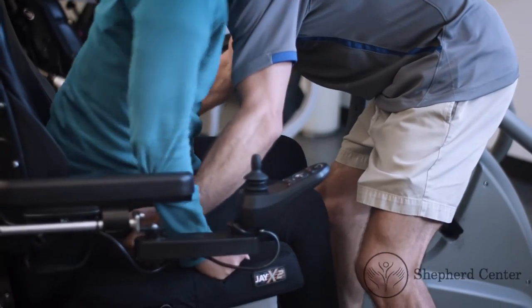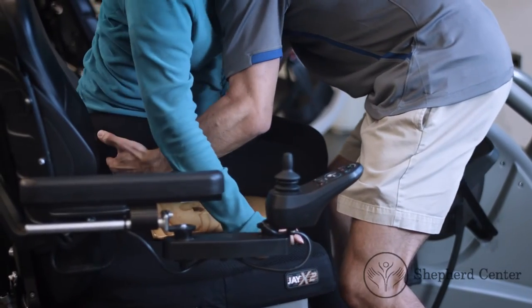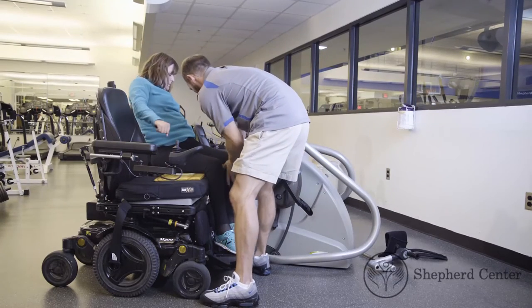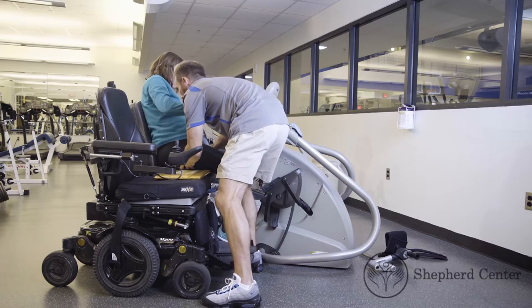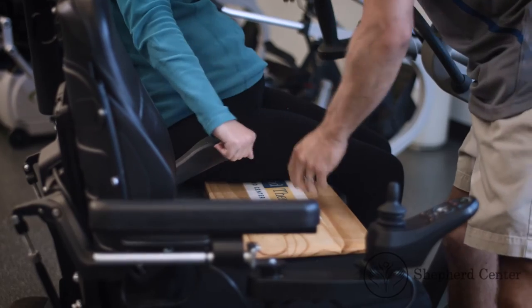Place your hands around the participant's hips and gently slide them across the sliding board from their chair to the exercise equipment's chair. Once the participant has transferred, have them lean to one side and gently remove the sliding board.